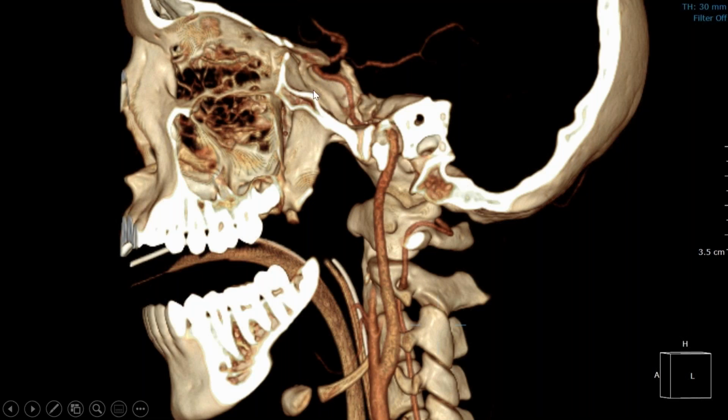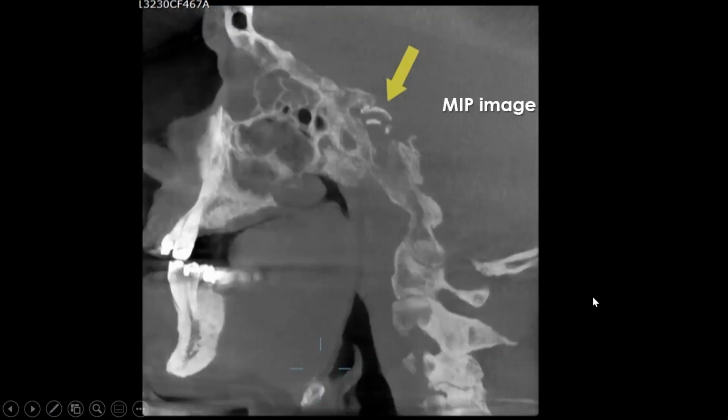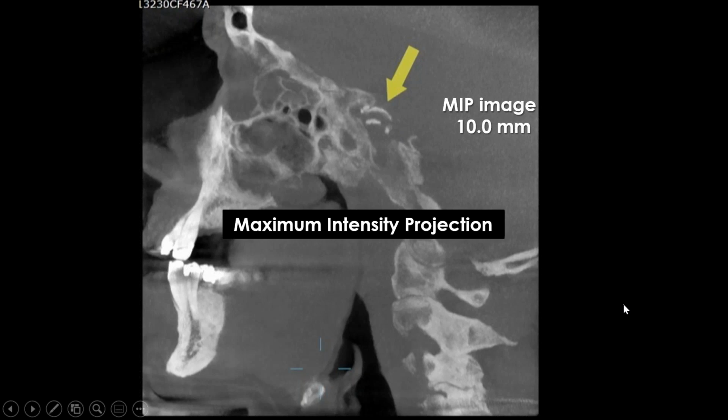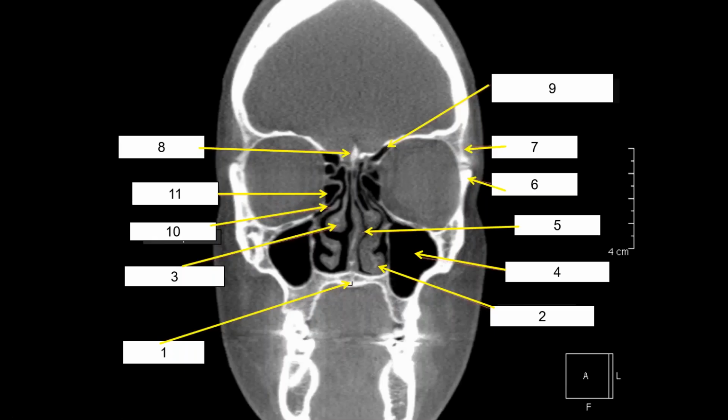So this is where I see the calcifications in all different planes of section. There's the rest of your mandible outlined. And this is what they'd look like. Again, parallel lines, that's MAC. I did the maximum intensity projection to make them stand out more, and they were referred for a diabetic workup. There's a valley, there's the nerve, fifth cranial nerve.